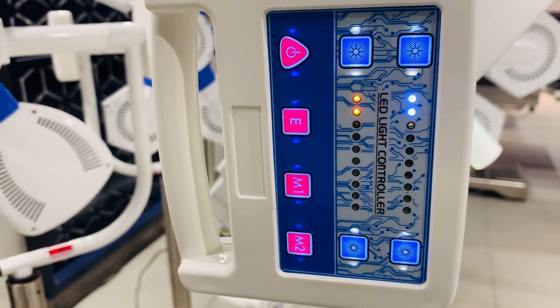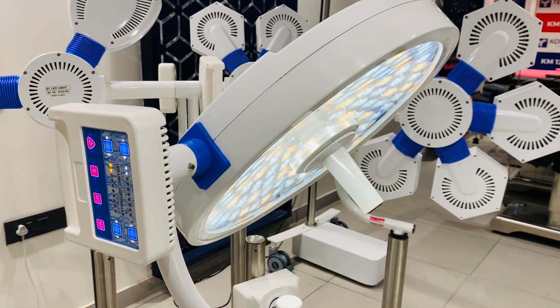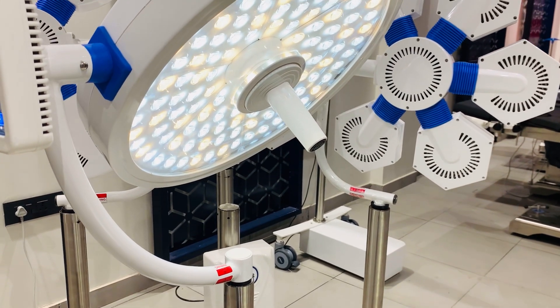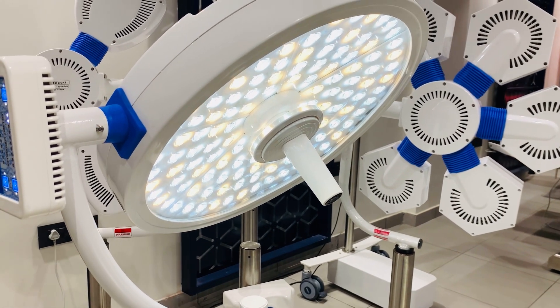This light is available in single dome, double dome, mobile model, and mobile model with battery backup. Battery backup is an optional feature with this light. If you want additional optional features, those would be a wireless wall controller and 360-degree rotation in the dome.